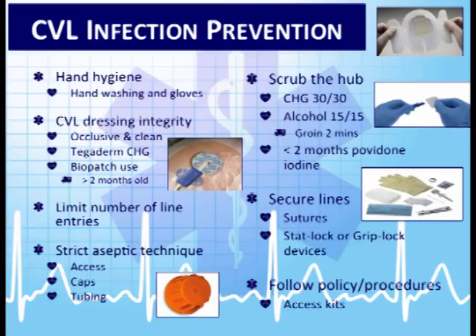So when picking a patient up from a facility, the central lines may have that. The PICC lines may just have the regular Tegaderm on there with a securement device.